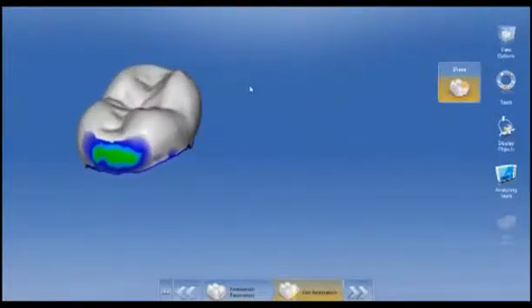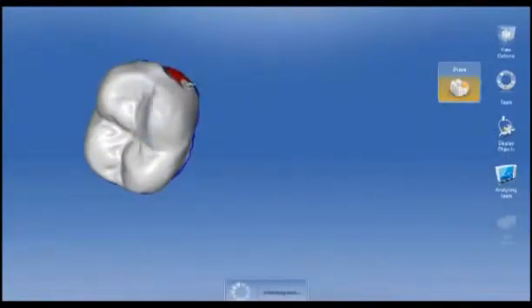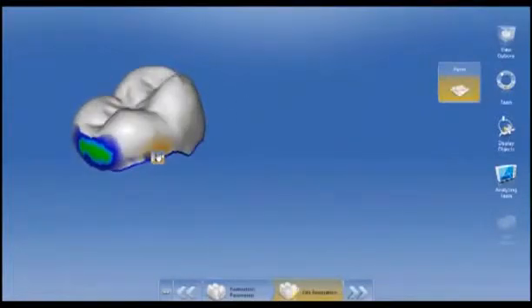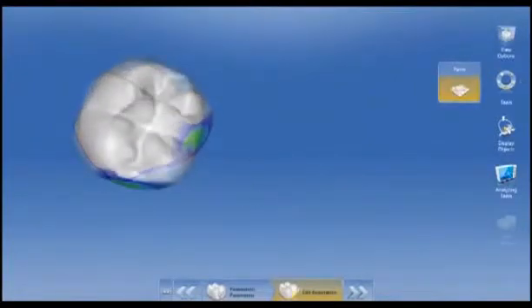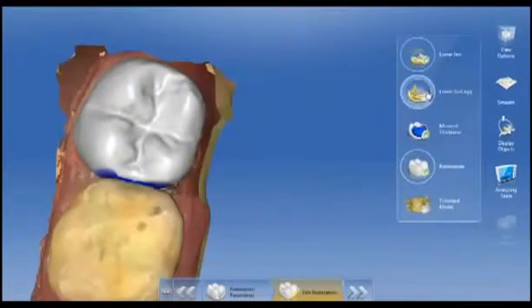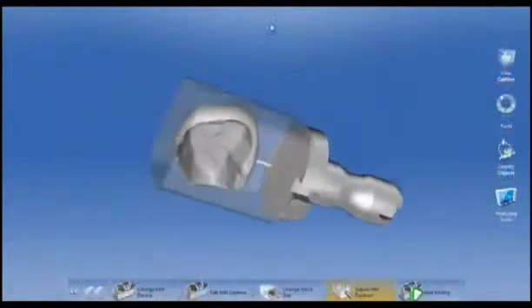So we'll select the tool wheel, go to a smooth or melting tool, and then just melt out those little rough areas. The last thing I'm going to do is fill in just a little bit on the lingual. It under contoured that, and I'm going to fill that in. What you're seeing here is not adding to the margin, it's just more of the contour, and get it nice and smooth. Now that we have the proposal completed, I can check it and verify it with the gold crown three-dimensional shape, and that's the speckled surface you're seeing there. And now we're ready to mill the restoration.